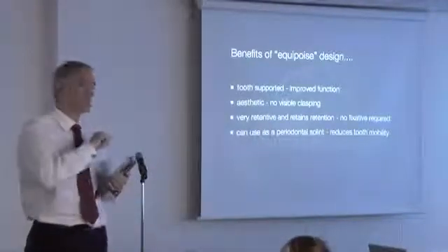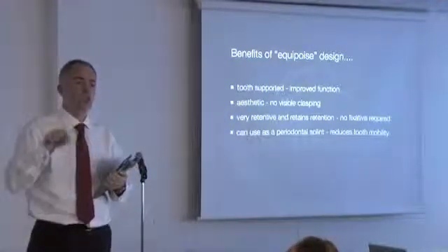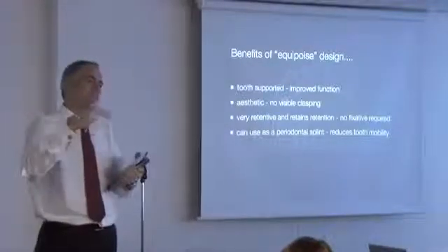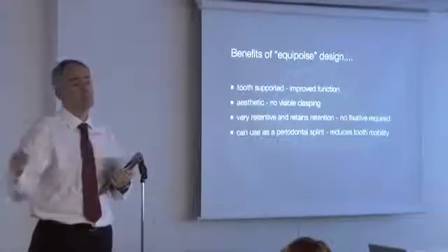You can design something like this, no joke, so that one tooth will hold the whole denture in place. So it can be done. Not how you'd want to design it, but if you get to that point, that's the end game. It means that denture may have lasted them 10 years.